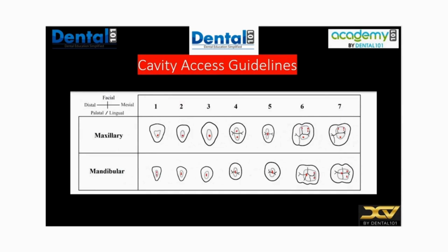As of now, with regards to the access that we tried, the only issue we faced was that we could not feel the drop during the access prep. So we are hoping to see if the manufacturing changes or the teeth changes, and it might be a bit easier with that. But apart from that, don't panic. Stick to the criteria that you have been following for every tooth and do the same.